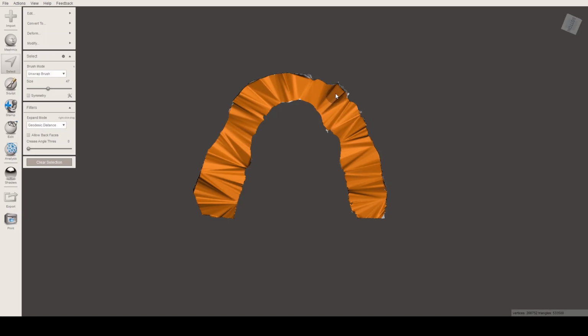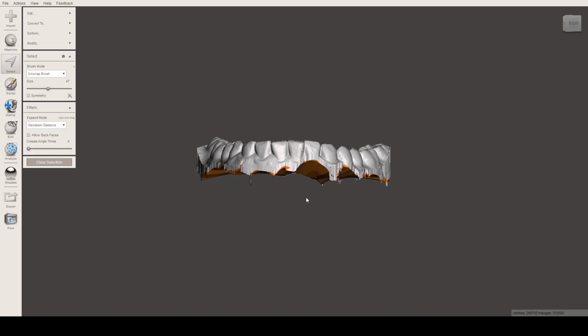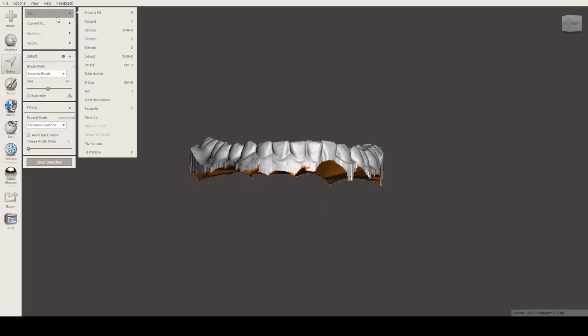So we basically selected almost all the area. Let's just leave nothing behind. Okay, now what extrude will do again is add up a layer. We can actually manipulate the layer, how thick we can add up to it, and yeah, so let's extrude it. It's not bad actually, but I hope it doesn't have errors because sometimes it has errors.